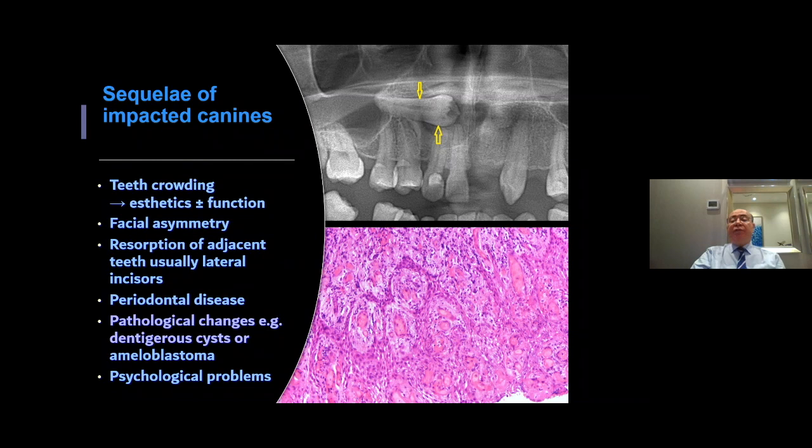I actually consulted with Dr. Chowdhury, who is our consultant radiologist, and we did the CBCT, and it turned out that that particular cyst or lesion is perforating not only the sinus but also the palatal aspect.